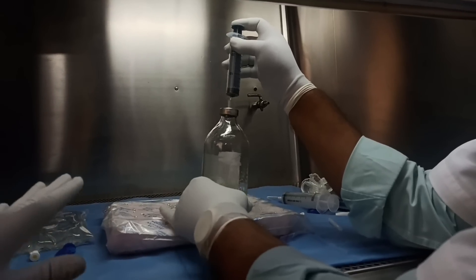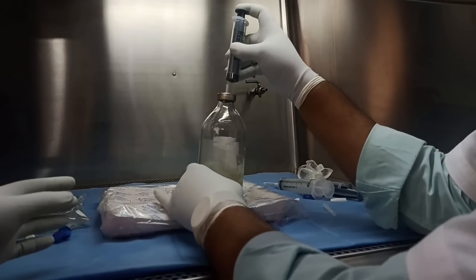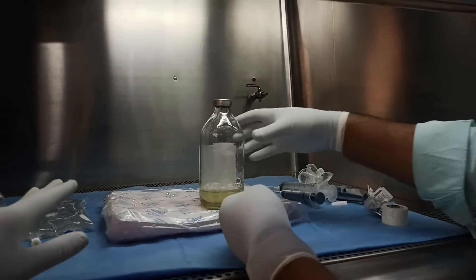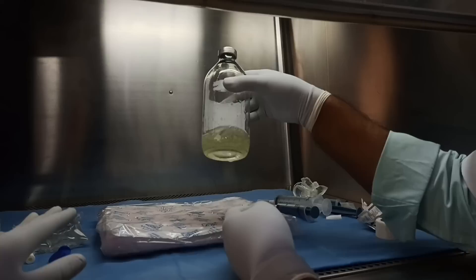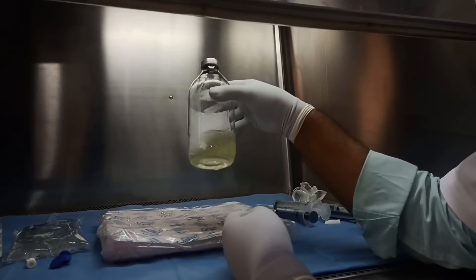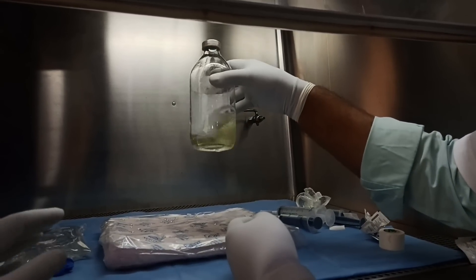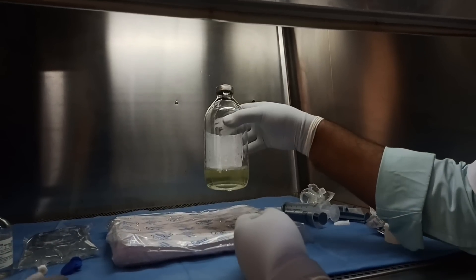We have now transferred all the albumin inside the bottle and have been constantly mixing it. We now have 100ml of cryoprotective solution ready for use. This should ideally be used immediately; if not, it can be stored at 4 degrees Celsius for about 24 to 48 hours. There should be no precipitate or clouding — we must ensure the solution is transparent with no opacity to confirm a good cryoprotective solution.